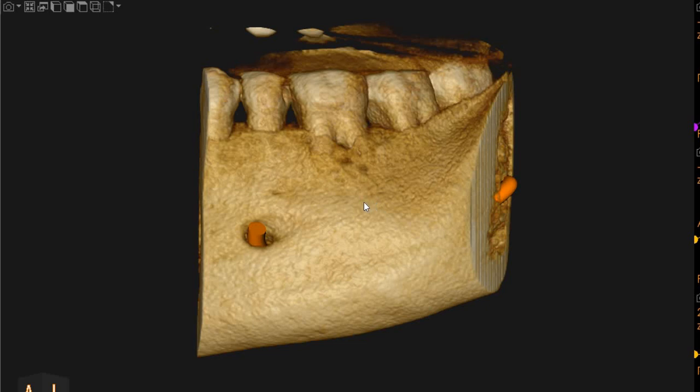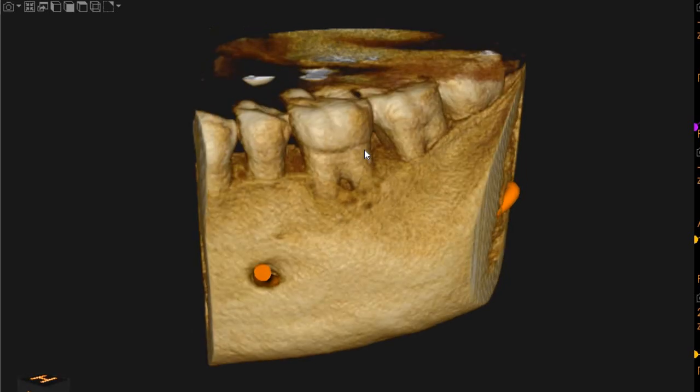Assalamu alaikum. Anka-Skan Diagnostics here. This is the CBCT of the patient which you had requested. The area of interest is the lower left six and the presence of a fracture.